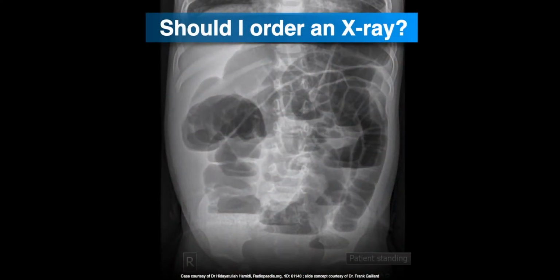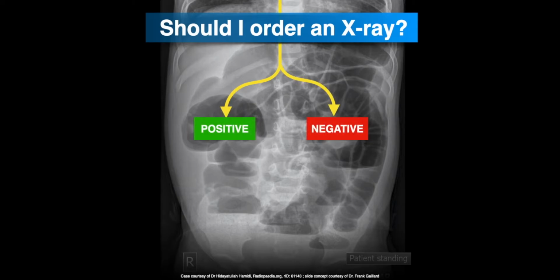This is often particularly the case for X-ray in the acute setting, and that is because a positive exam is unlikely to give you a specific diagnosis that can guide treatment, and a negative exam is unlikely to be reassuring enough to stop the workup. And there you have your donut, both positive and negative results leading to a CT. There may be some indications, such as stool burden, foreign body, and tube placement, that X-ray does well, but more often than not, you'll be looking at a donut.